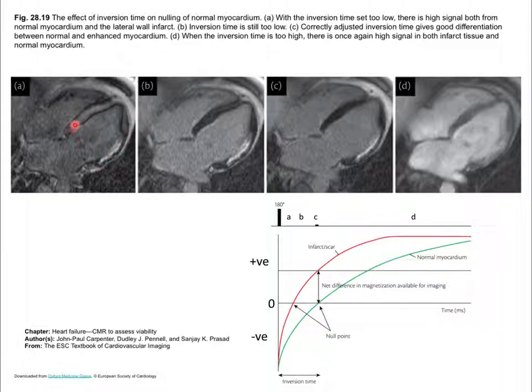The myocardium obviously is still negative at this time, so it's still below 0, because when you make an image of the magnitude of the magnetization vectors, we're getting an averaging between the myocardium and the blood. And the myocardium is negative magnetization. This is positive. And so where they meet, it becomes 0. And so you get this very interesting effect or artifact, whatever you want to call it, in which the partial volume of the blood and the myocardium here give you an outline.